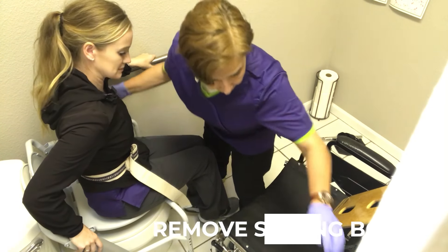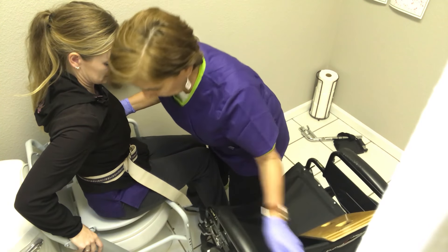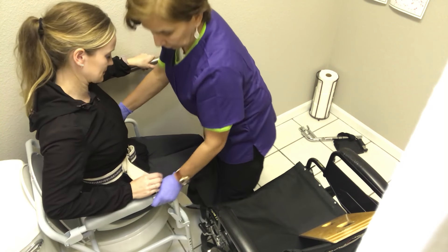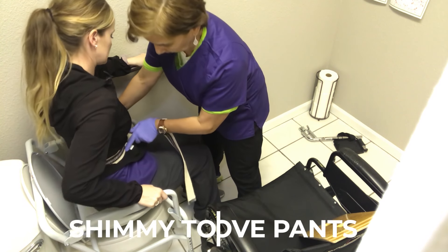I leave the wheelchair here — usually I keep the wheelchair there for safety — and I can pull this up. Once they're there, we can work on shimmying the clothes off.